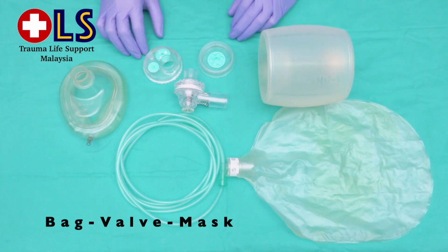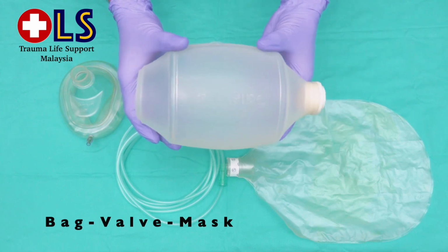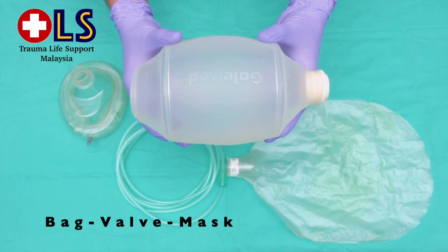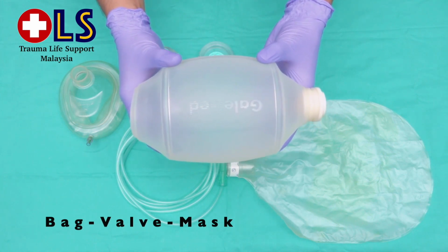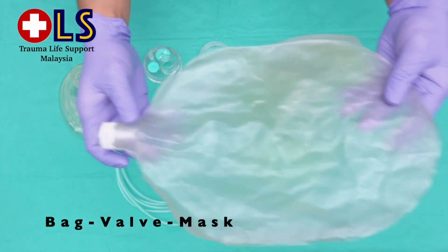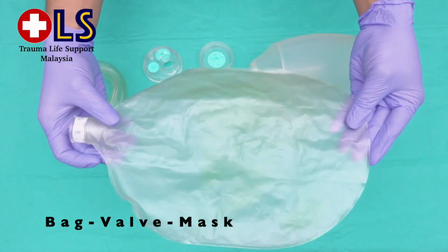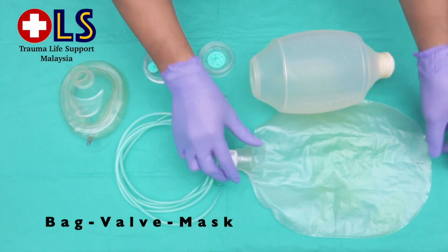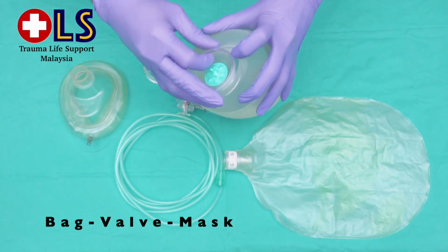The bag has 3 sizes. For adult, 1.6 liters. For infants and children, we use 0.5 liters. And for neonates, we use 240 mils. This is the reservoir. It comes in 2 sizes, 600 mils and 2600 mils. Now, let's assemble the device. First, make sure all the membranes are there.